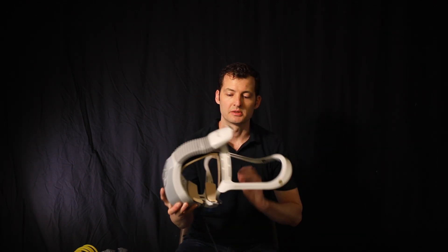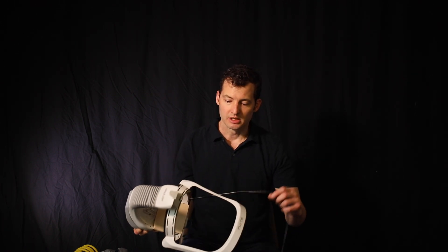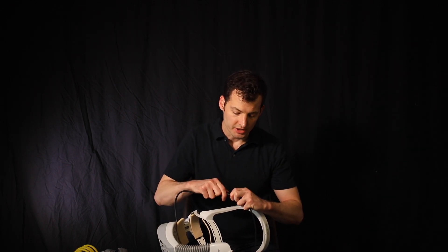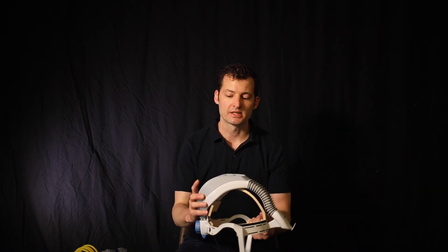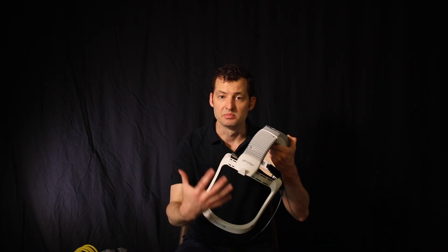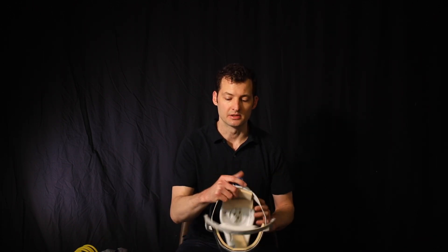This is a Stryker helmet commonly used by orthopedic surgery in the operating room — it's just head gear already laying around the hospital. We're not going to use the fan or the battery, so you can go ahead and disconnect those. You can see it already has a fan built in and already has an air supply that blows in front of the face, which is perfect for what we want to use it for. We're going to tie that airline into the back of this here.